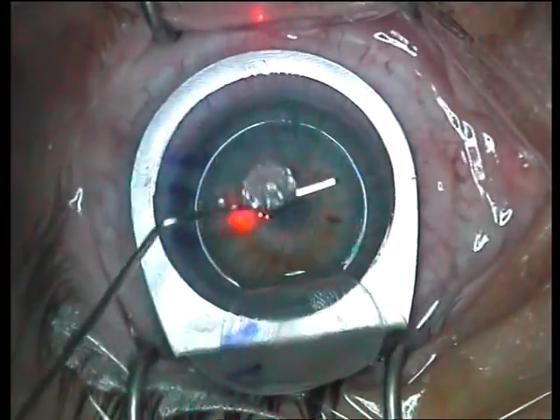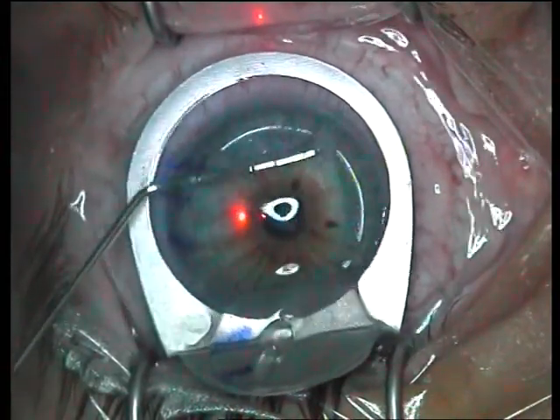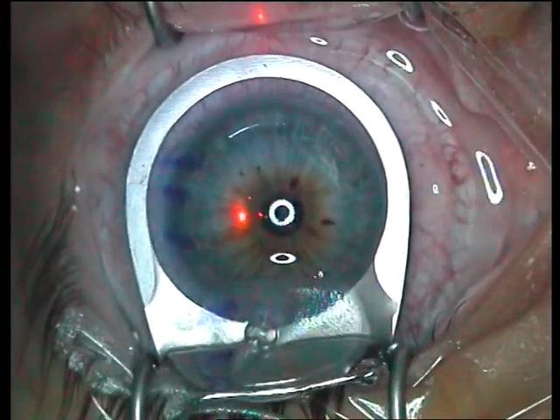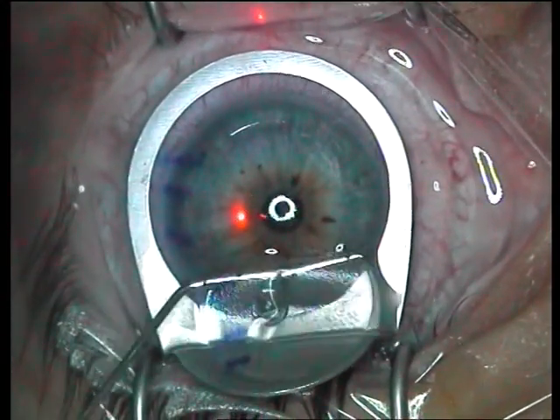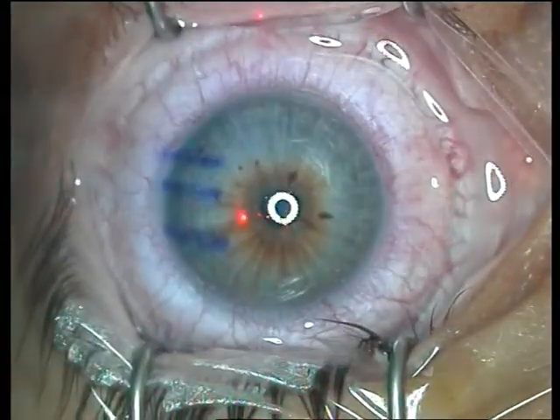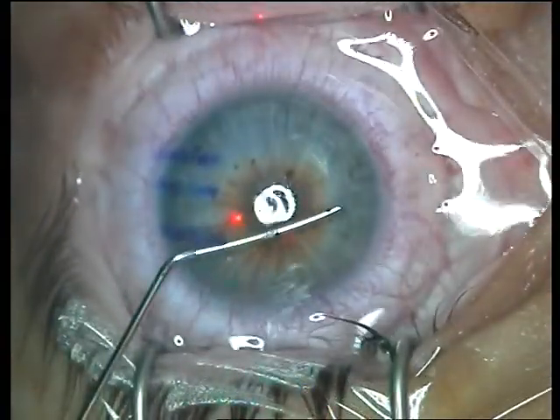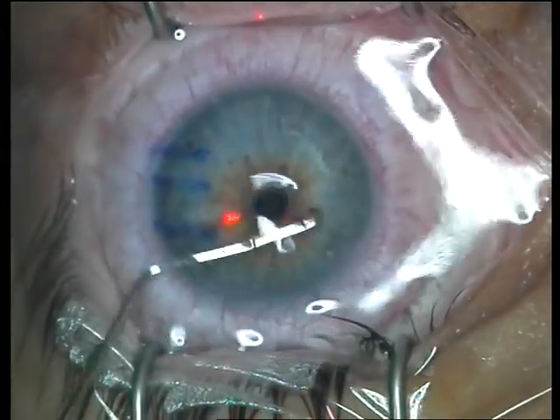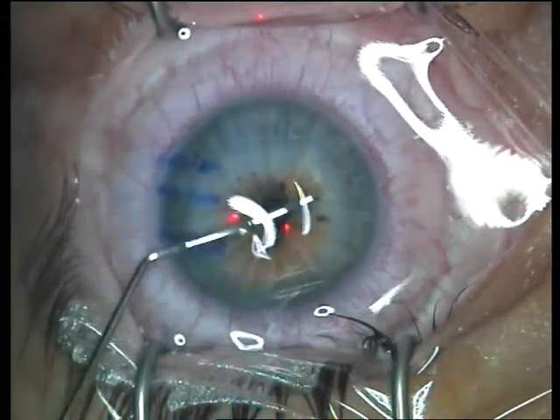The Banaji LASIK cannula is now used to irrigate the bed, go under the flap, lift it off the flap rest and gently lay it on the cornea. This flap rest allows for an absolutely precise and clean method of keeping the flap completely away from any contaminant on the surface of the eye.